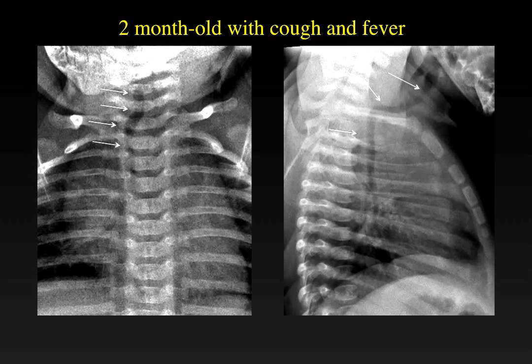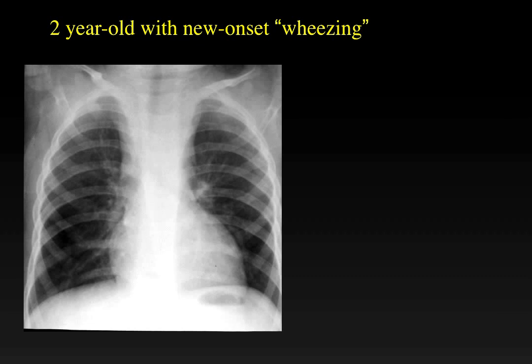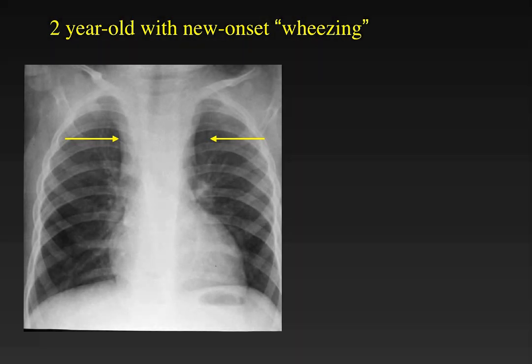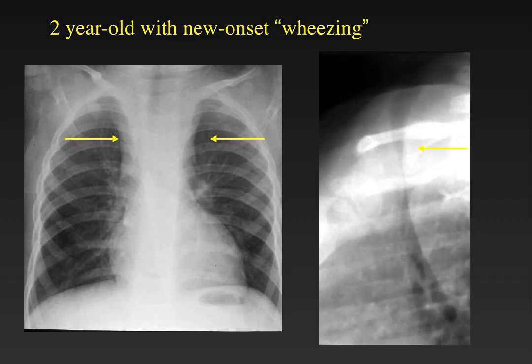Compare this trachea to a two-year-old who presents with new-onset wheezing or stridor. The first thing we see is that the mediastinum in this child is much too wide for a two-year-old. At this age, the thymus is much smaller and should not be so dense. On the frontal view, the air column of the trachea becomes less well-defined as it courses down towards the carina. On the lateral view, there is marked anterior displacement and narrowing of the trachea by a mass pushing it from behind.